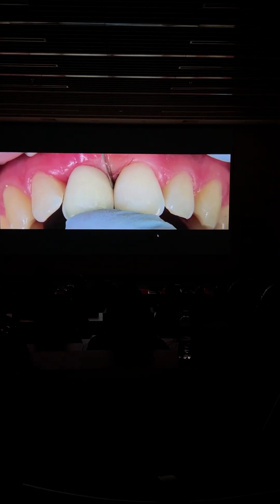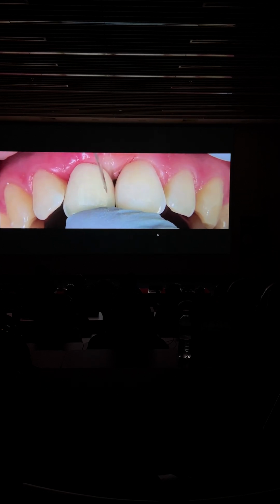You can see I open the space. How much do I open? Pretty much level to the contralateral papilla. Okay? So I would love those papillas to fall instead of closing the spaces and opening the black spaces. Many technicians in the world, as soon as they see a black space, they close it. Here is totally the opposite. You open it because we have grafted interproximal.